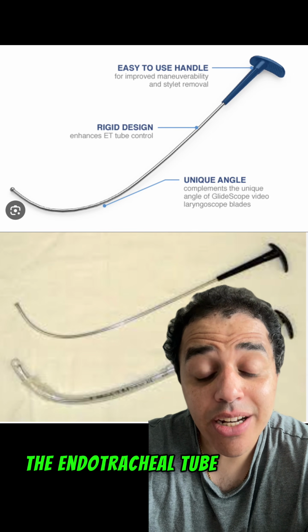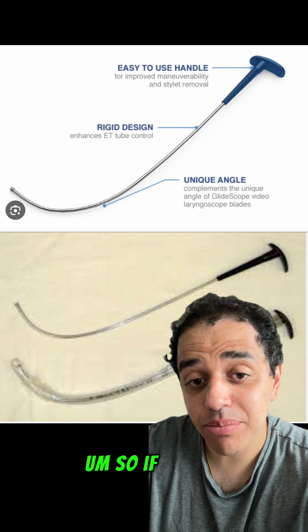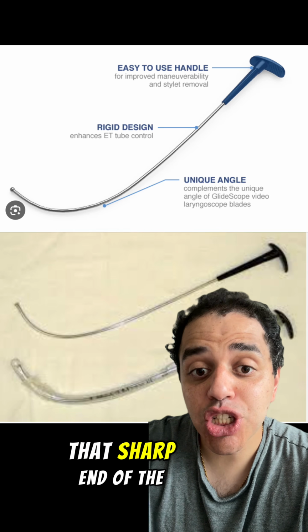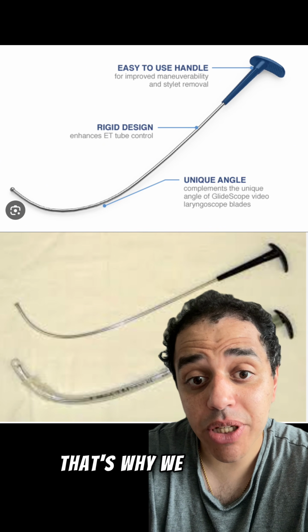Okay, never mind. So it gives the endotracheal tube structure, so it's easier to pass through the vocal cords. It's sort of more tough to move through the vocal cords. And also because you can angle it however you like. So if you want to follow a certain angle, you can bend the tube a certain way to follow that angle. But the downside is it can cause trauma, right? You never want that sharp end of the rigid stylet to be poking out of the end of the tube, because if it does, then you can injure the trachea. But that's why we use the rigid stylet.